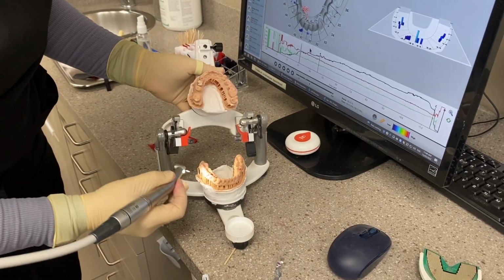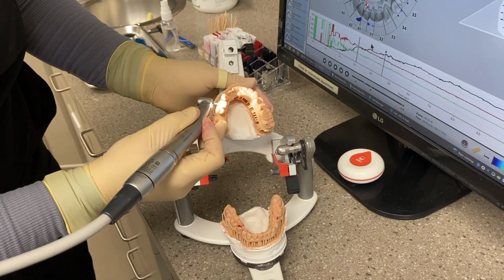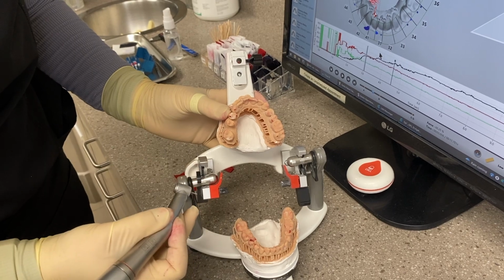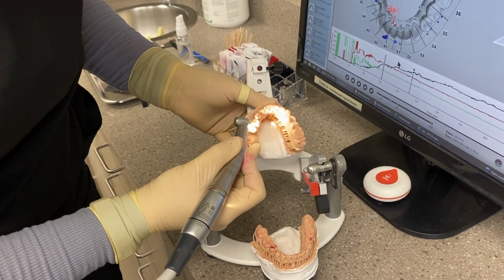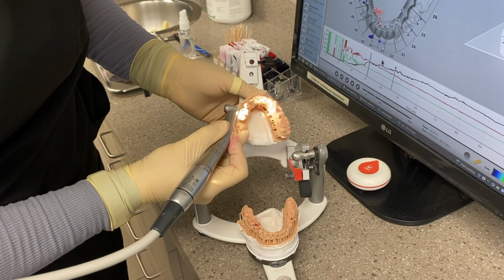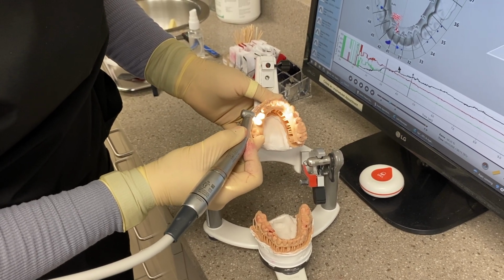And this is the other thing, I probably won't be adjusting the lower anymore because I already know I'm going to be rebuilding this tooth. So we might as well do the majority of the adjustments in that, as opposed to exposing two teeth to invasive treatment. So I'm going to take this one right down, knowing that she's going to need some sort of maybe an onlay to cover up that cusp from being so exposed.